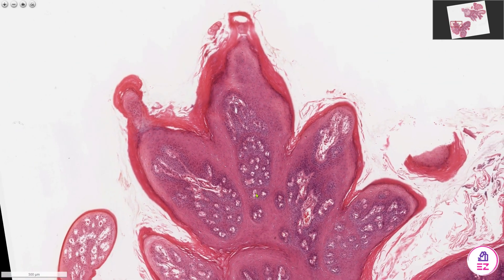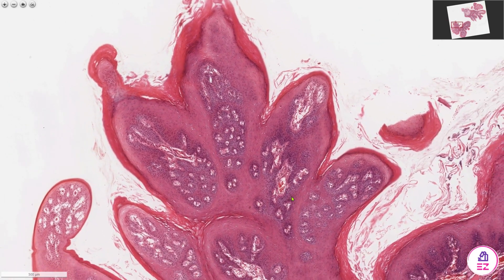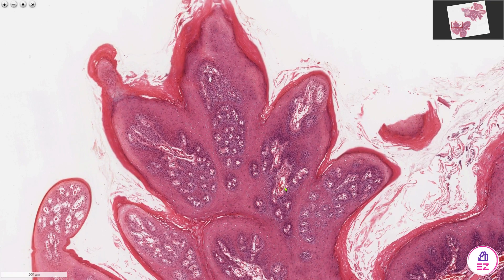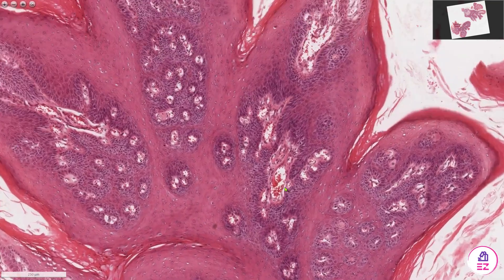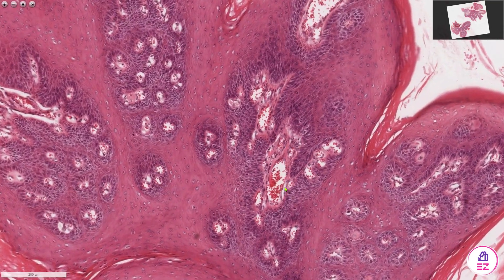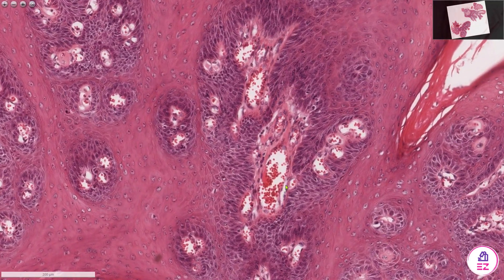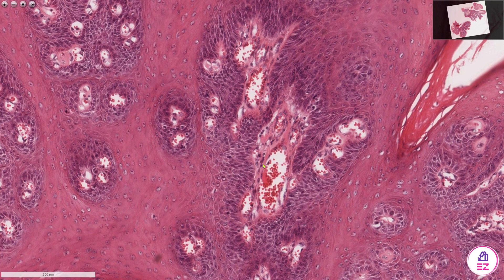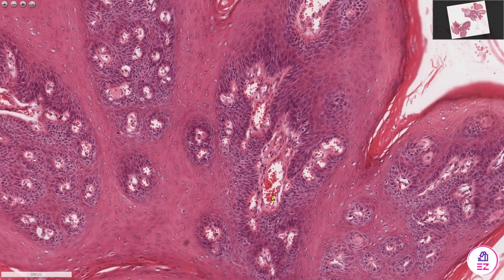Another thing to notice is that the connective tissue cores supporting these papillae tend to be highly vascular. I can identify multiple small vessels, and they tend to be quite congested with red blood cells as well.